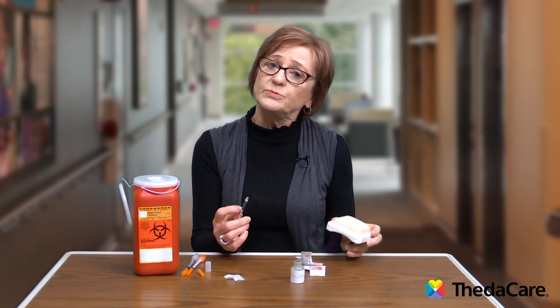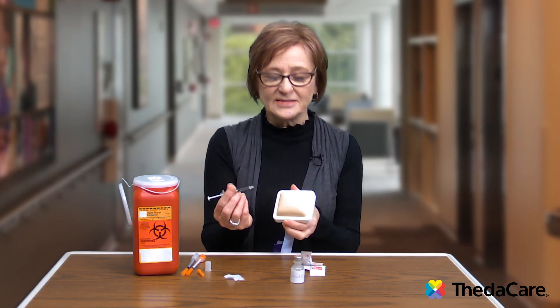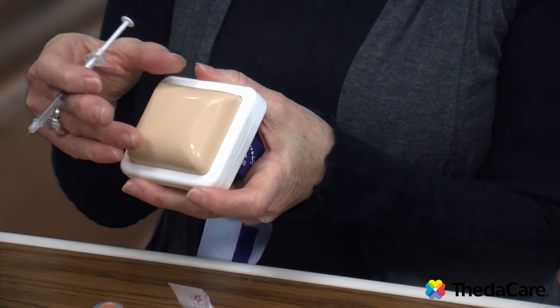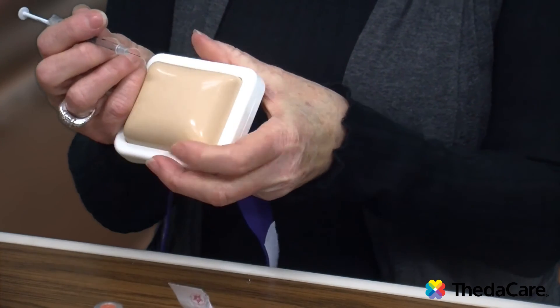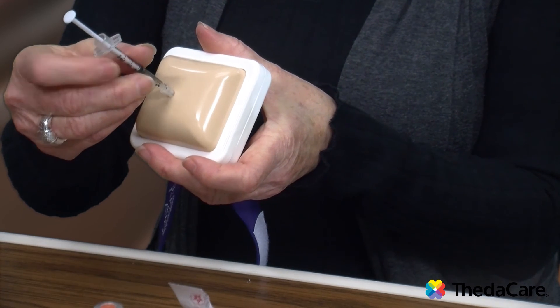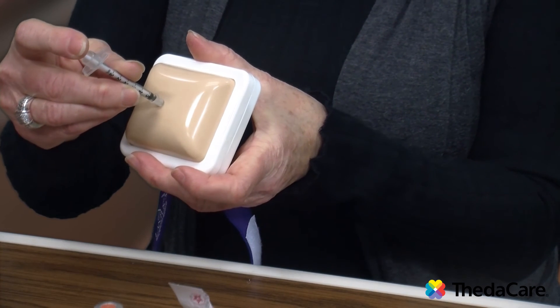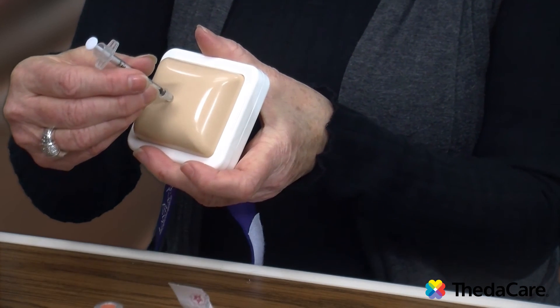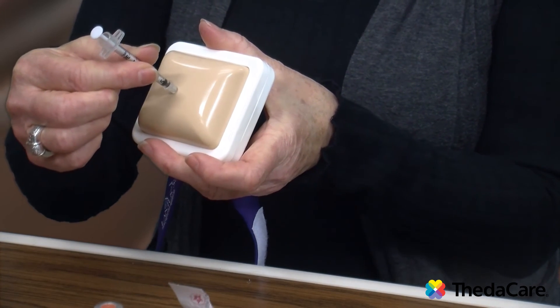Typically, for best absorption, the abdomen is a good place to choose. Depending on the amount of fatty tissue you have, you may choose to pinch up a fold of skin — otherwise it's not necessary. Take your needle, go straight in, and slowly push the insulin in until you've pushed the plunger all the way in. Then wait for about 10 seconds before you pull that needle out, so it allows the insulin to absorb. After 10 seconds, pull it straight out.